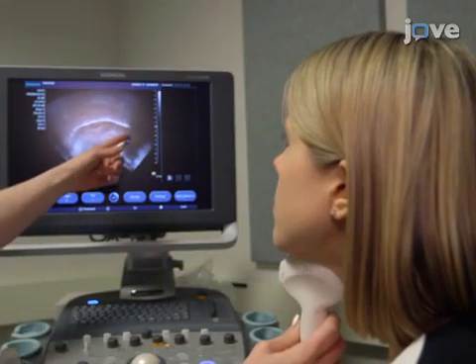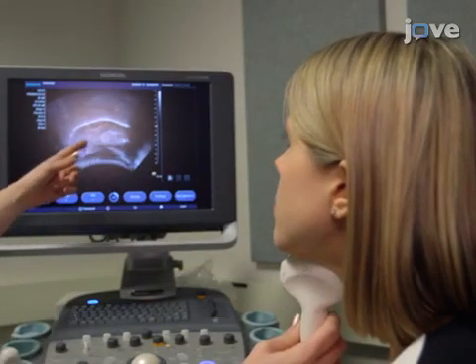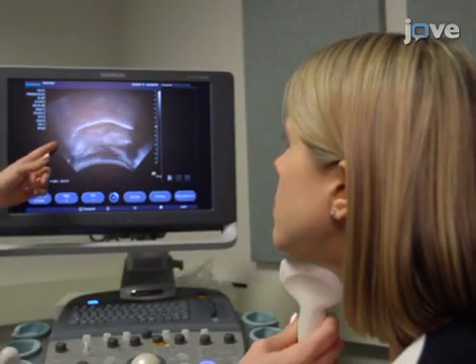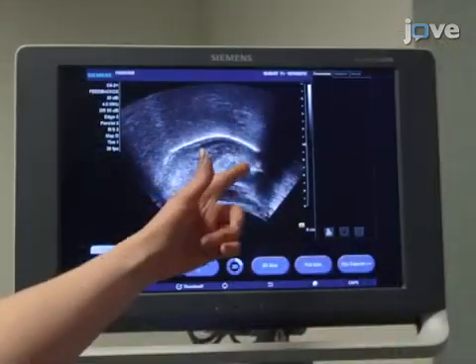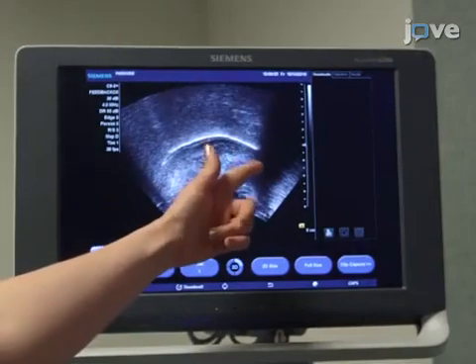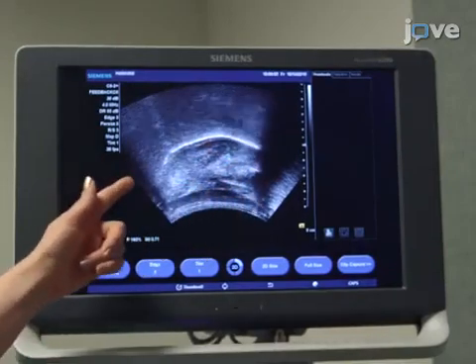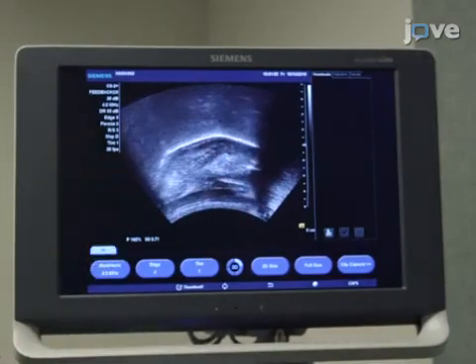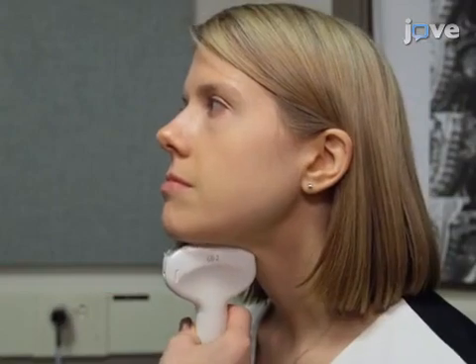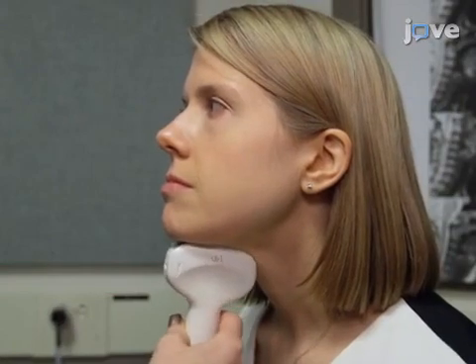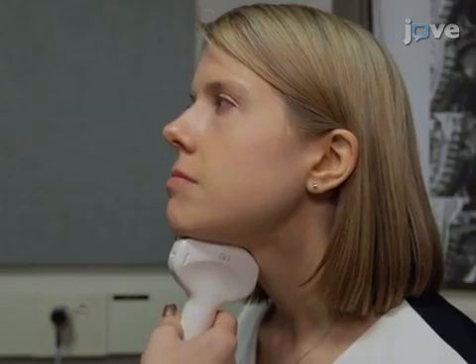Check the screen to verify that the transducer is properly oriented, such that the front of the tongue is on the right of the screen and the back of the tongue is on the left. Angle the ultrasound transducer slightly forward or slightly back depending on what part of the tongue is of interest.